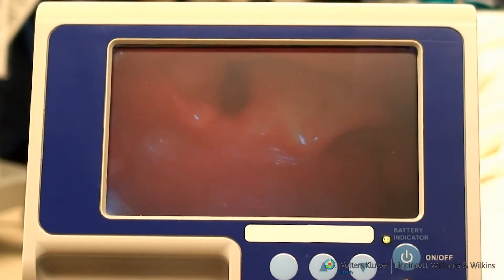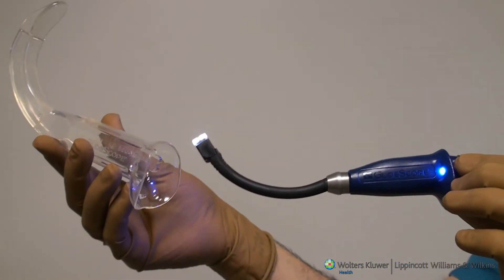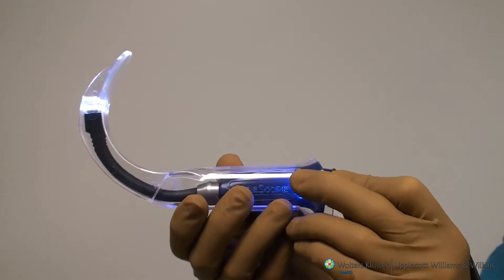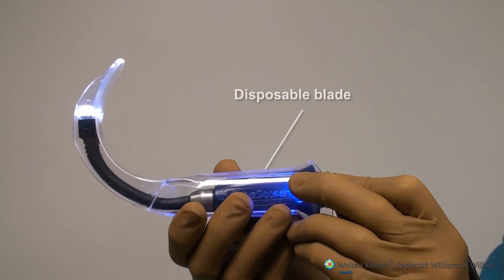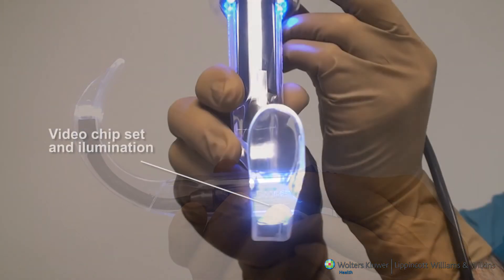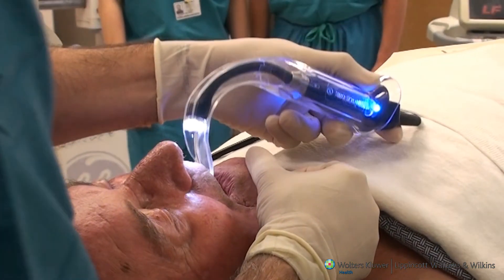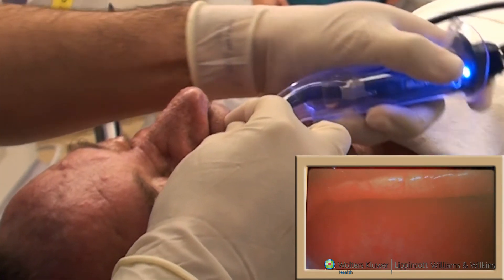The GlideScope provides an electronically projected image on a video monitor, resulting from a video chipset at the distal end of a conventional light laryngoscope blade, but with a more acute distal angulation. Here we see a demonstration using a transparent GlideScope disposable blade. Illumination is generated at the distal position. The GlideScope can be handled with a skill set similar to that used with a conventional laryngoscope.